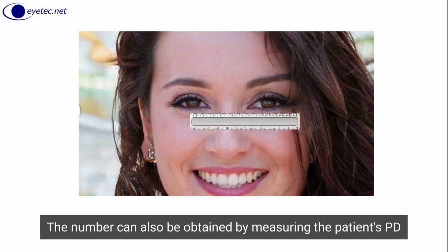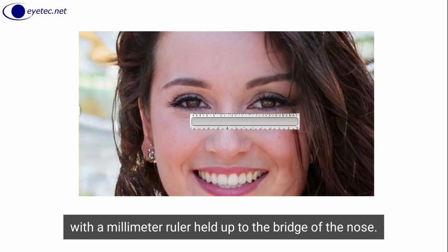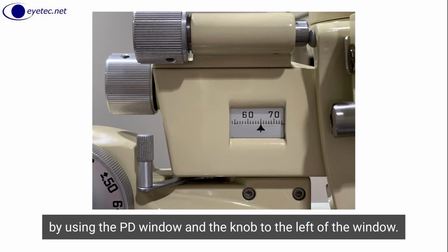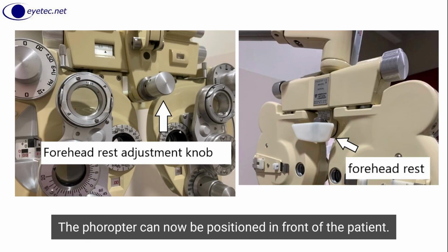The number can also be obtained by measuring the patient's PD with a millimeter ruler held up to the bridge of the nose. The phoropter PD is matched to the patient PD by using the PD window and the knob to the left of the window. An average PD number is about 64 millimeters. The phoropter can now be positioned in front of the patient.